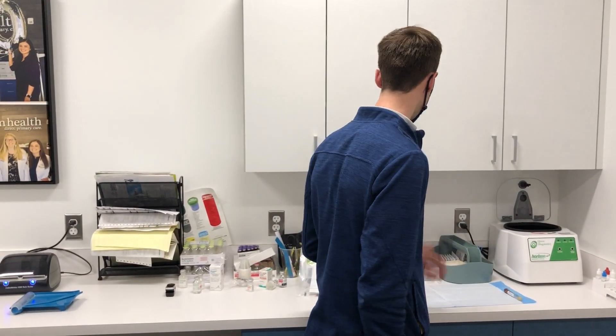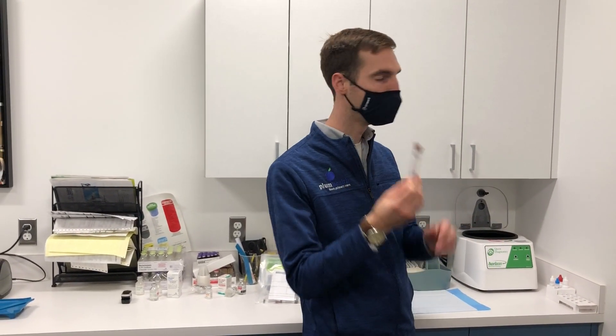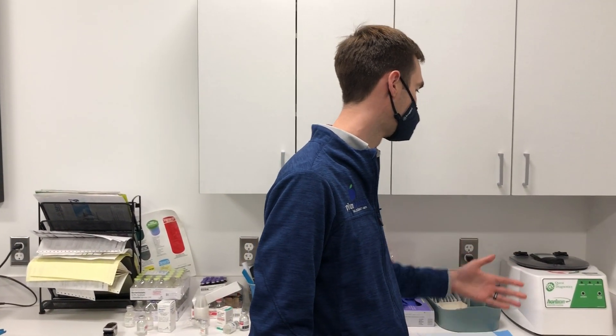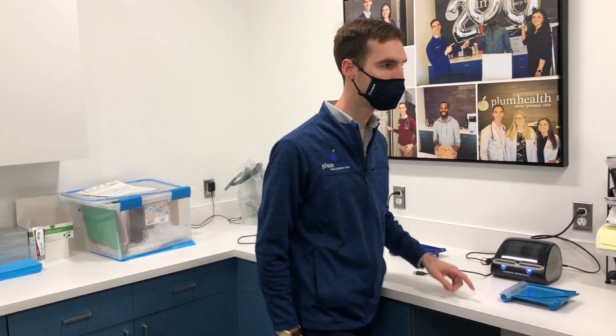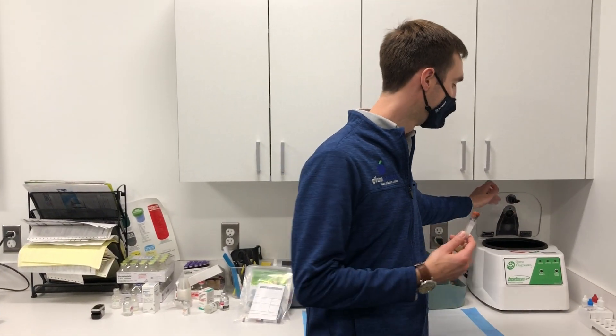Once we have that all together, we set the tiger top tube into the centrifuge and centrifuge that down. That centrifuge is about a foot by maybe 14 inches — it's pretty small. Then I'll set up my laptop adjacent to one of these printers and print a label that will go on to the tiger top tube or the lavender top tube, whichever tube it is.